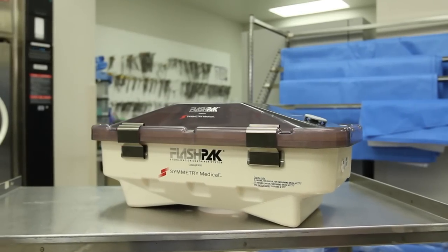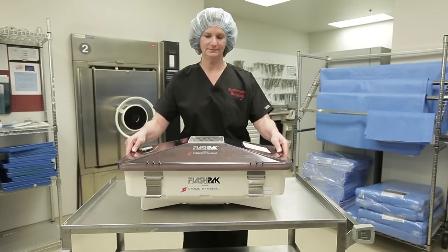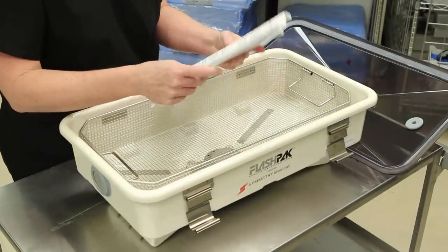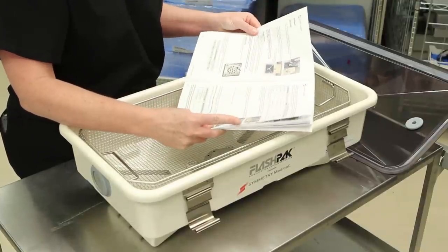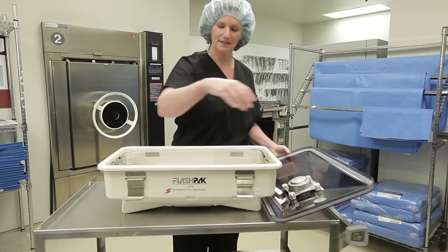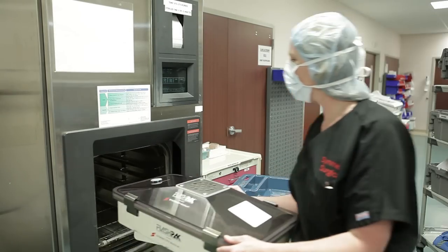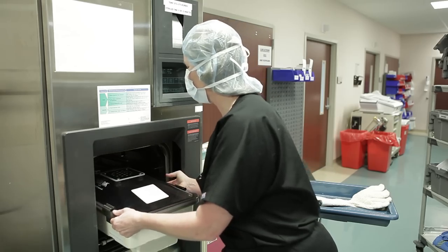Symmetry Surgical's FlashPak is a hospital-proven mobile sterile field that meets applicable standards for immediate use sterilization. In order to keep your FlashPak functioning properly, please follow the instructions in this video. If maintained properly, your FlashPak will provide a consistent alternative to traditional sterilization methods. The FlashPak is a reusable, rigid container system designed for immediate use sterilization in pre-vacuum steam and gravity displacement autoclaves.